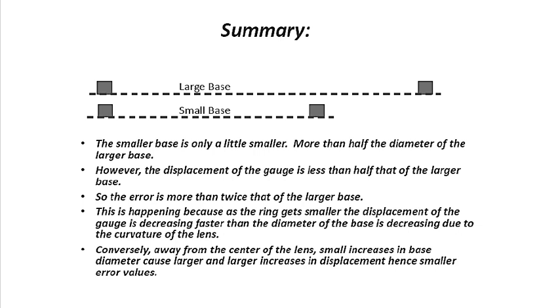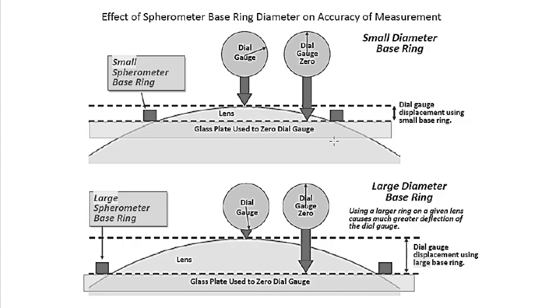So when you take a look at that curvature of the lens, see that? So here is your diameter. The diameter is decreasing because it goes up. Your lens goes higher and higher, so your diameter goes down. And of course, you're also using the base number 7. So base number 10, you're going to have a bigger diameter.